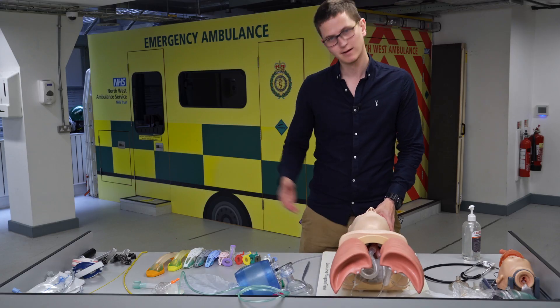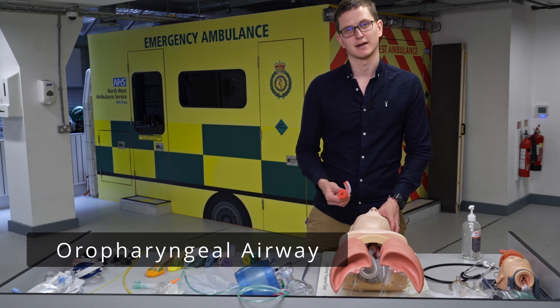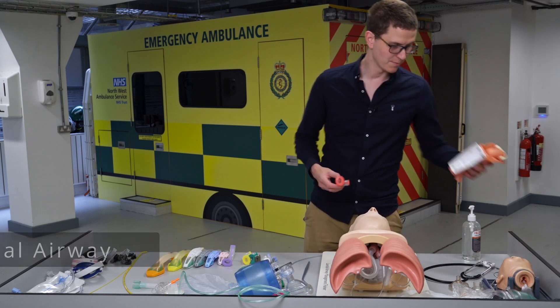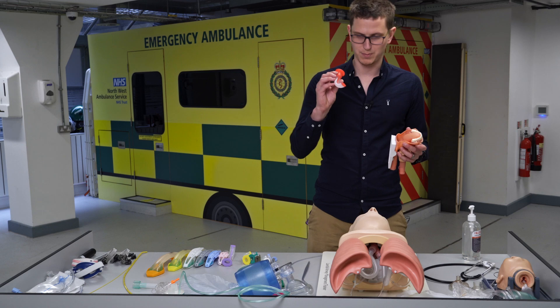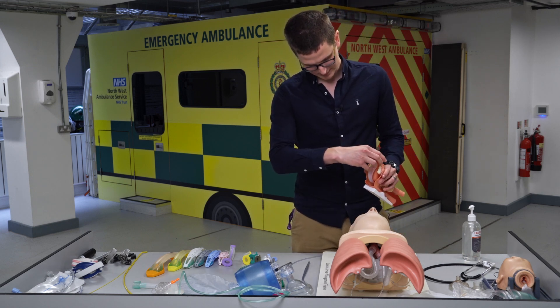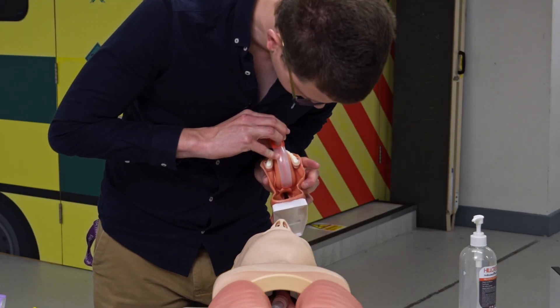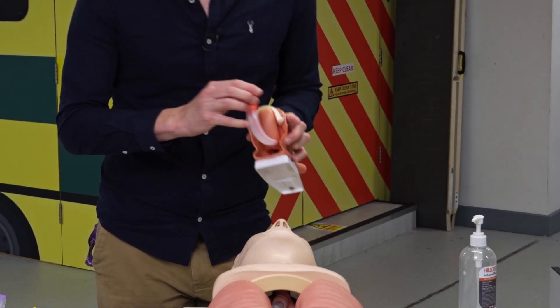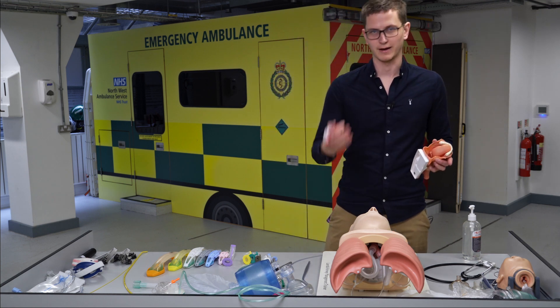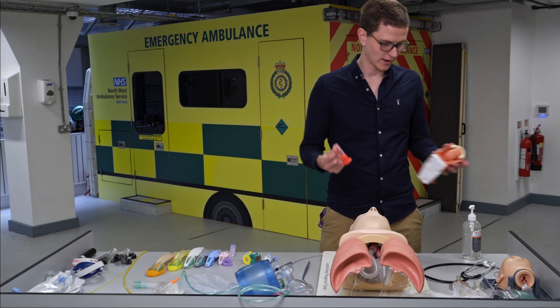Next are the adjuncts. Let's go to the OPA — oral pharyngeal airway. What this does is lift the back of the tongue up. We place it in, and it keeps the tongue up and out of the way of the trachea, therefore keeping the tongue away from blocking air movement. If the patient doesn't have a patent airway, this can create a patent airway.